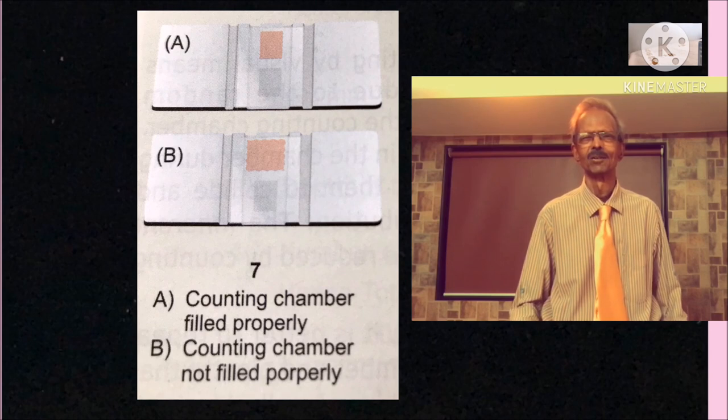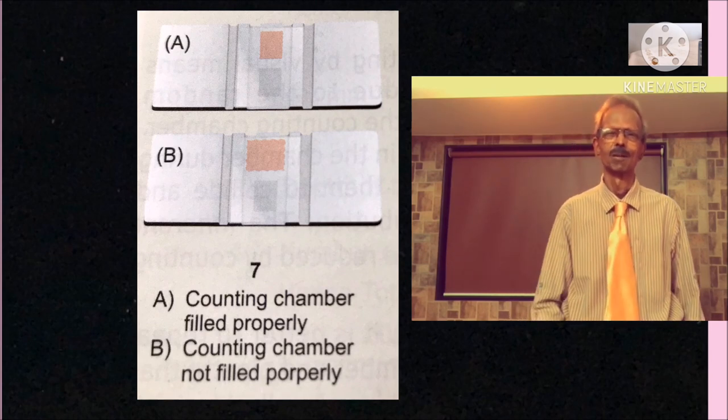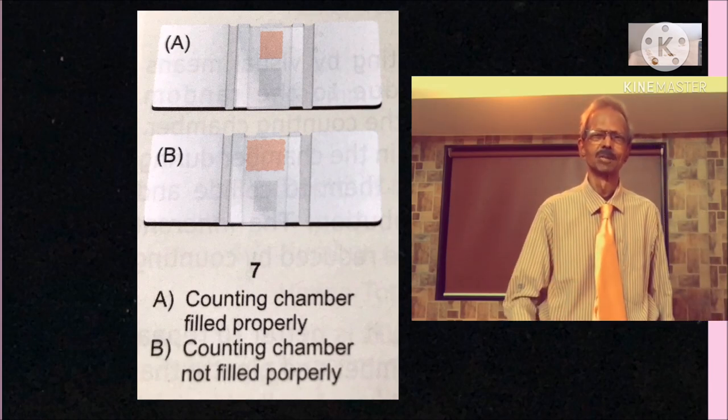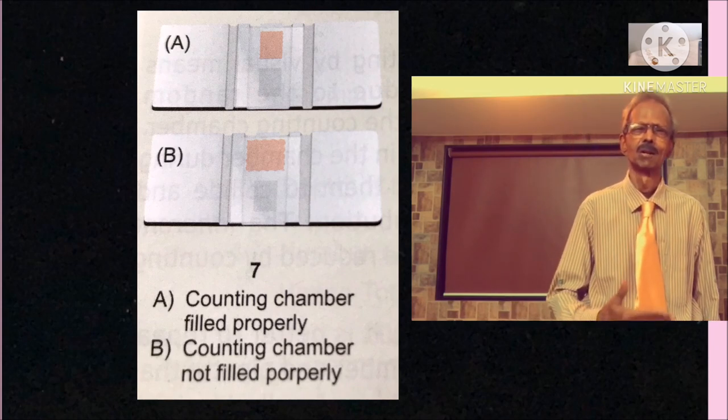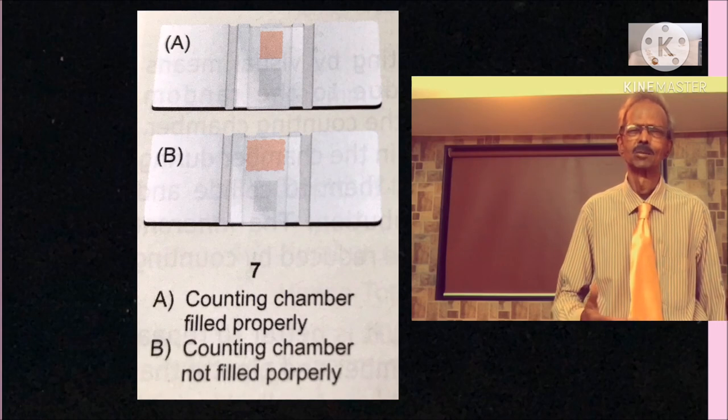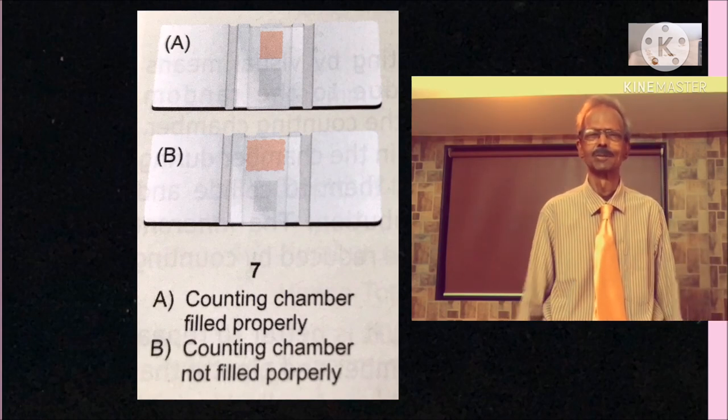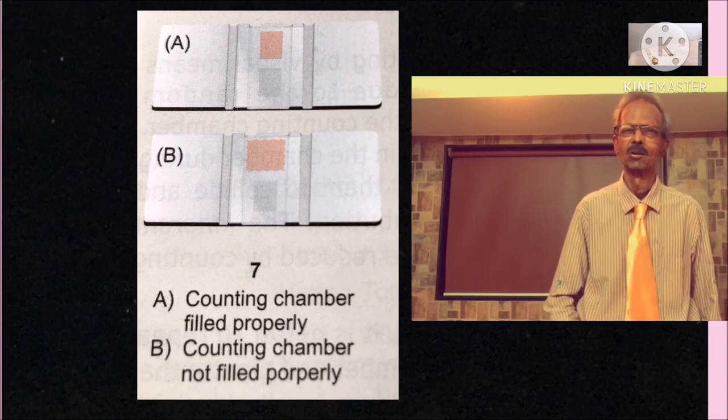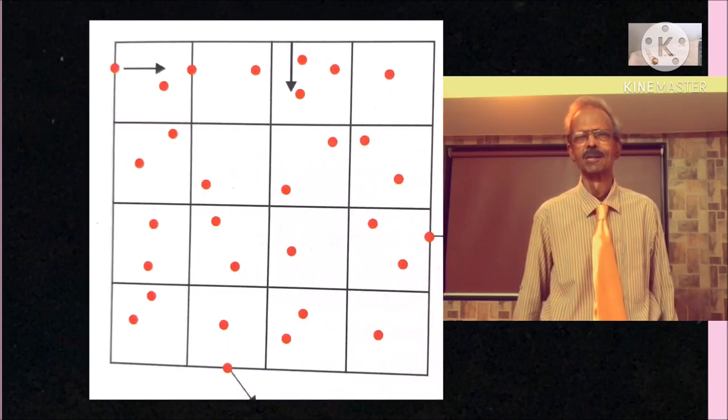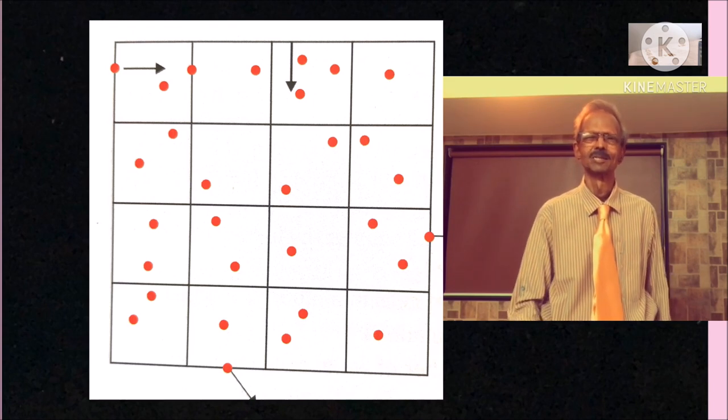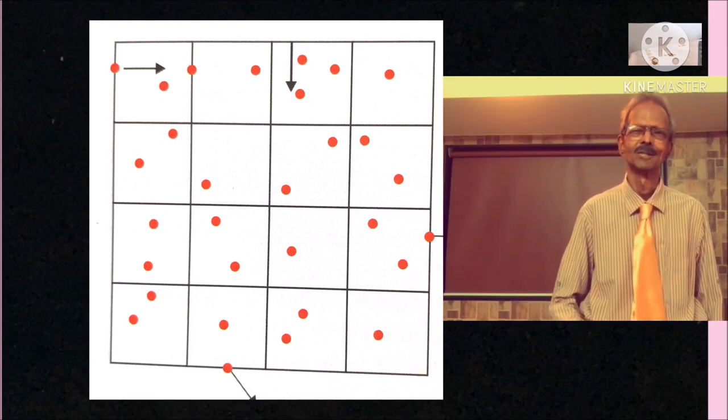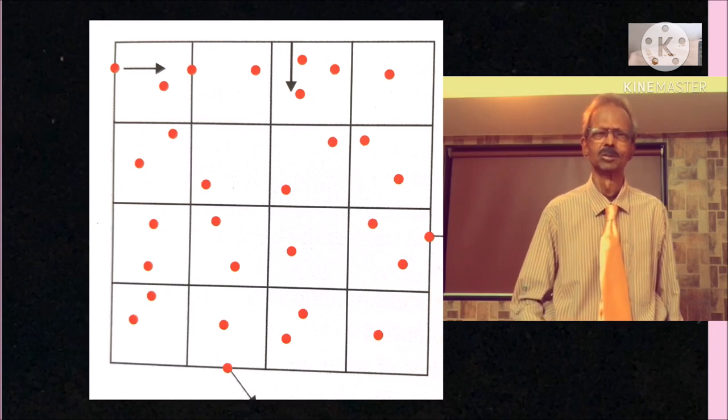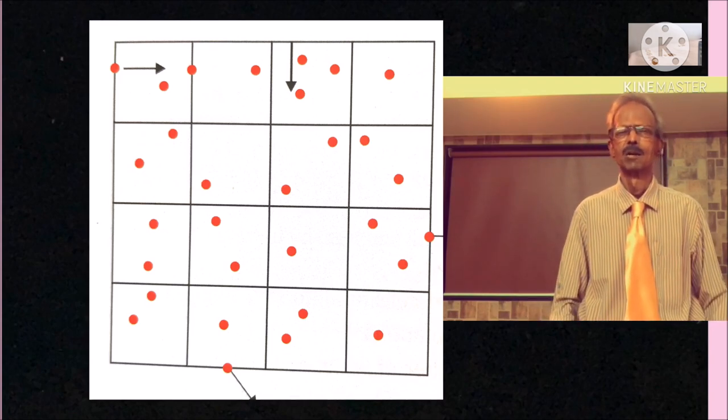In blood cell counting, you must take good precautions for accurate cell count determination. First of all, practice filling of counting chamber well. As shown on the left hand side, figure A indicates counting chamber is filled properly and figure B indicates that counting chamber is not filled properly. Similarly, air bubbles should not be present. And when cells are counted, you need to count cells touching the border line of counting area also as shown on the left hand side but of only 2 of any 2 sides of the square. Then for proper understanding of microscopes and microscope practice, watch our YouTube video.